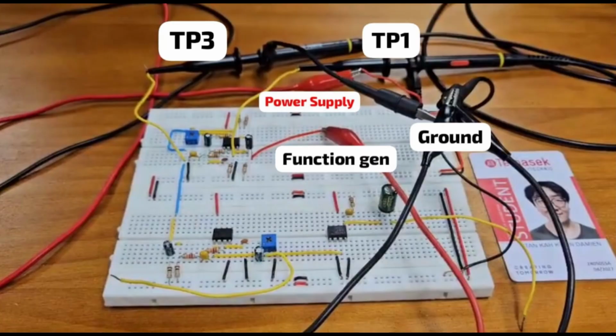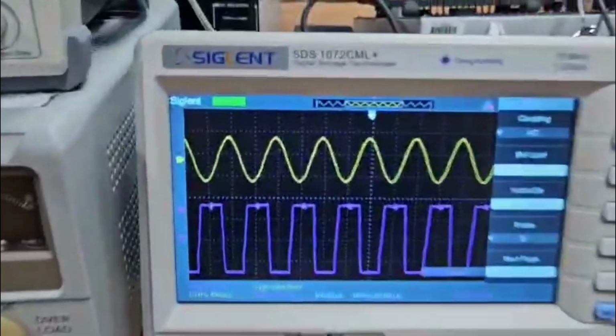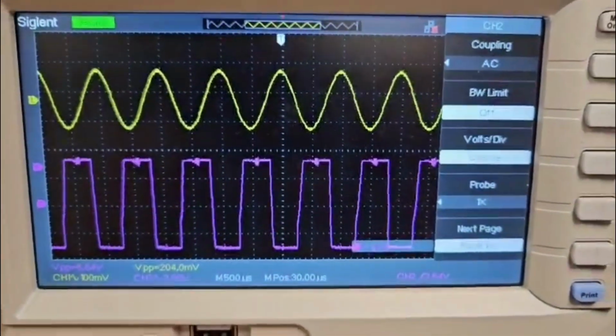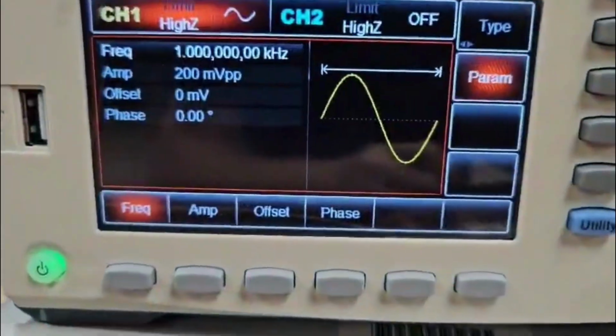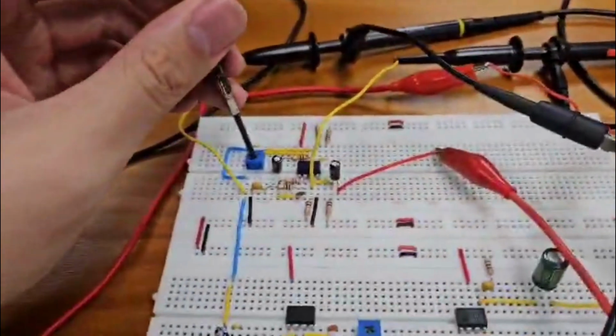Channel 1 is connected to TP1 and channel 2 is connected to TP3. So now I'll be showing how the trimmer affects the sine wave, and I set the frequency to 1 kHz, while VP peak is still 200 mV.